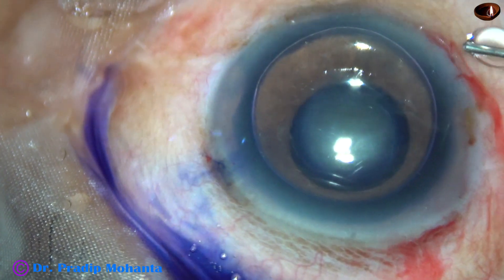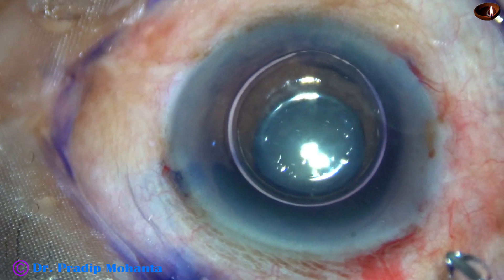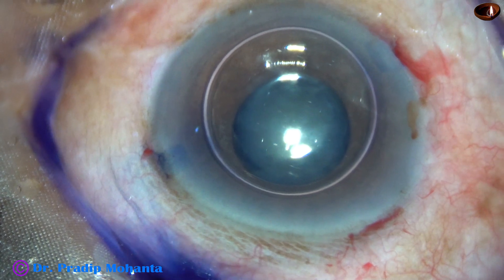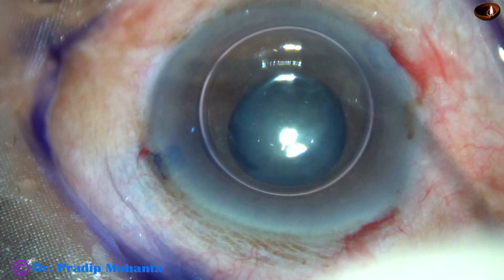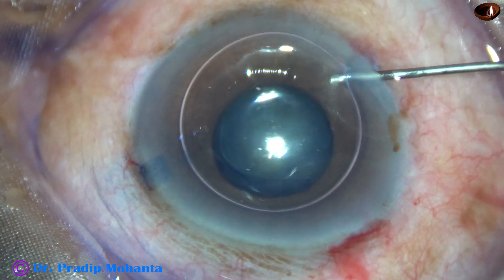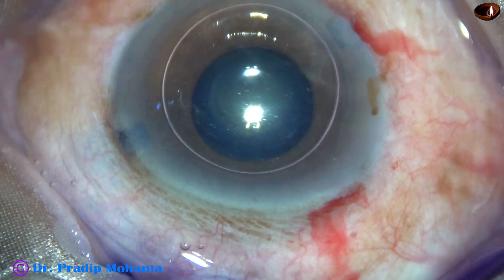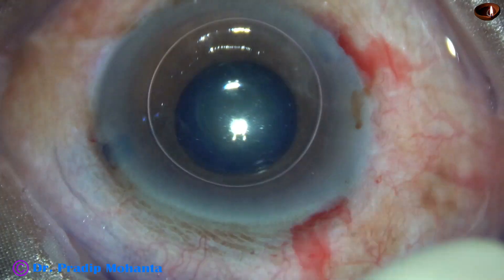This is a bit of phenocaine, which contains tropicamide, phenylephrine and lignocaine. And this is a bit of adrenaline. So with all these medications, the pupil didn't dilate.